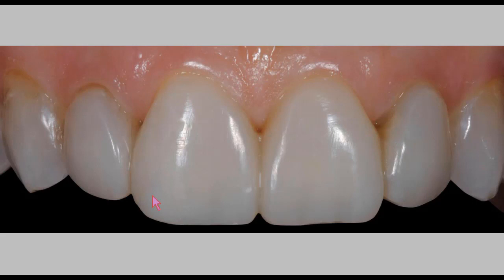I always have to think about what is the reason behind the fracture. Just don't think that the material fractured because it wanted to fracture. Normally it has a lot to do with occlusion. This was the case, so I went back, I adjusted the occlusion, sent the patient back home. When she returned for me to prep the teeth, no more fractures had happened. And you can see how nice and healthy the tissue was just a week later. And you can still see the spaces that I've created for her to use the soft picks.